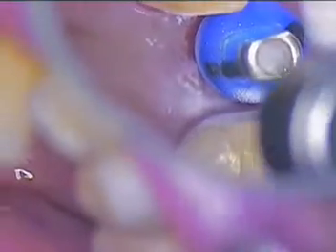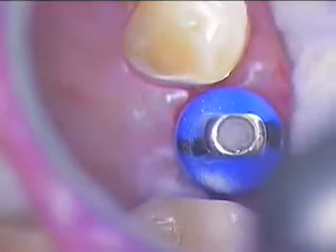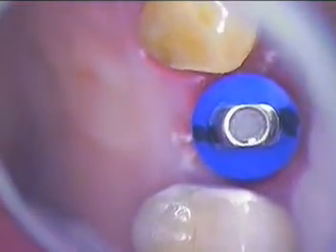It's also going to allow your lab to work very quickly and more easily when they prepare the model. We've got absolutely zero tissue collapse. Our goal is to get a replica of that soft tissue, and it looks like we're going to mimic the actual contours of that temporary — the soft tissue compartment of the temporary. That's about where I'd like it. I'm going to polish next. This is Jerry Cuomo — pick me up on the next segment where we go to take the impression. See you in a little bit.